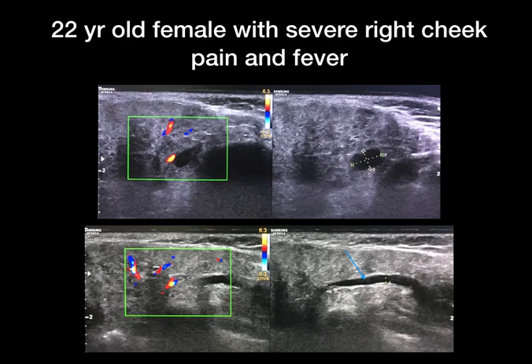USG of the right parotid gland is seen here. On the axial section, you can see the entire parotid gland is heterogeneous in ecotexture and slightly edematous.